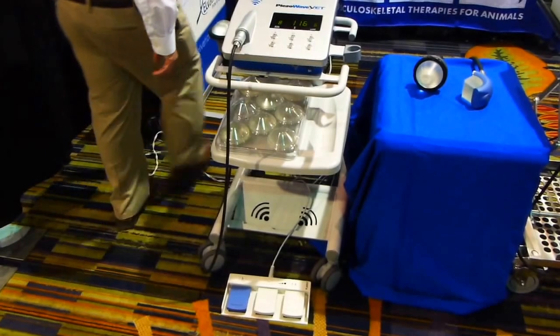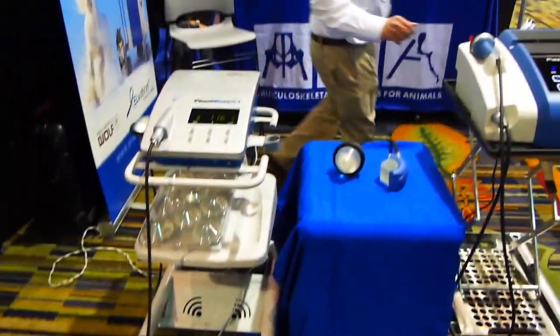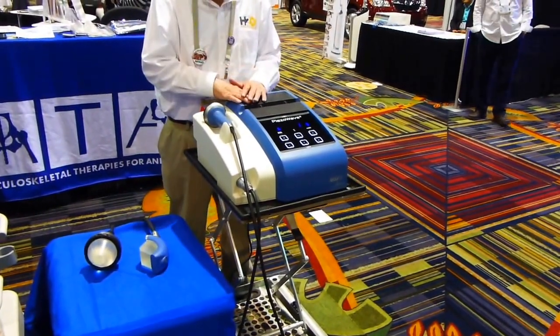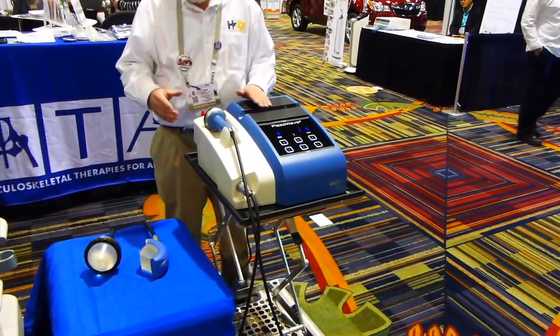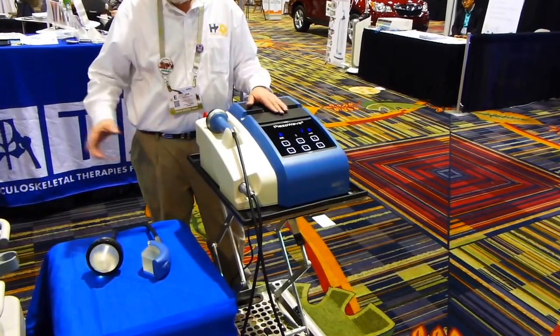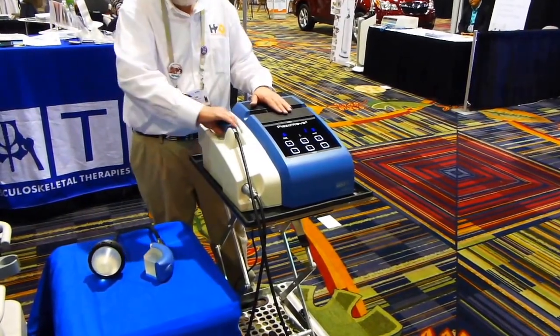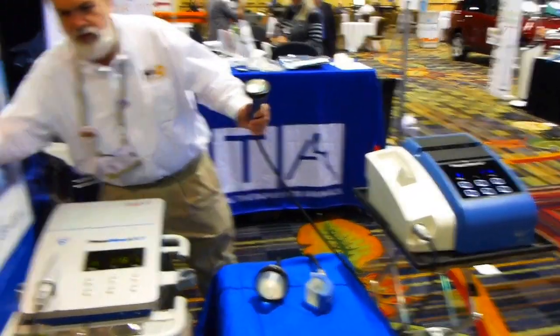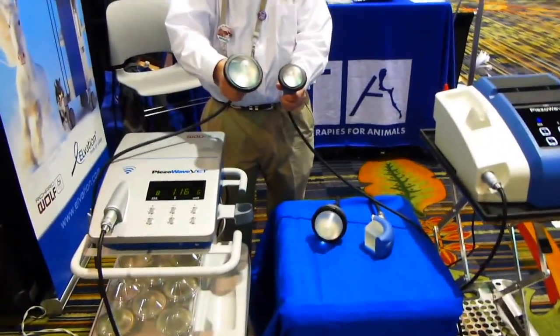The PiezoWave VET 2 is our newest model. There are a number of distinct advantages over this device. One, we can accommodate three different therapy sources — the much smaller F7G3, which is again most common for small animals.